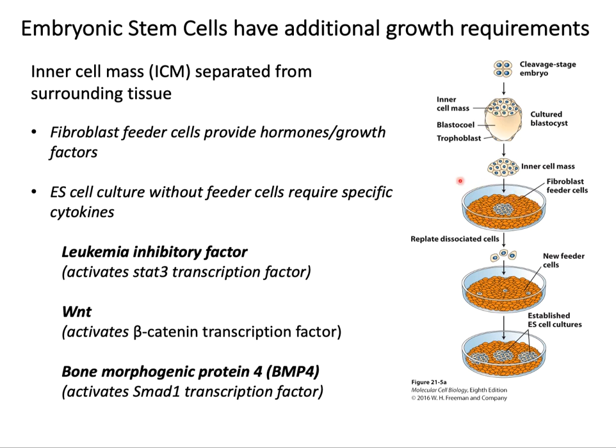When you are growing the embryonic stem cells on the feeder cells and then start measuring or quantifying certain physiological characteristics, the question arises, are you measuring the physiological characteristics of the feeder cells, the embryonic stem cells, or a combination of both? This problem is solved somewhat with the use of the cytokine instead of the feeder cells. And at confluency, the embryonic stem cells outnumber the feeders by almost 20:1. So it's not really a big issue. But again, this has been a problem in embryonic stem cell research.